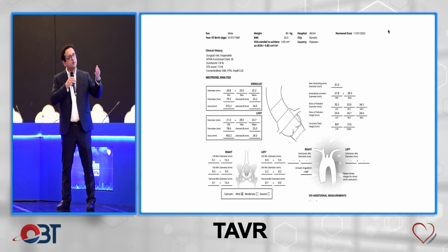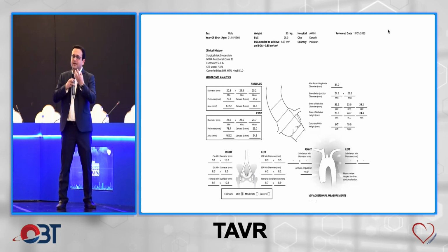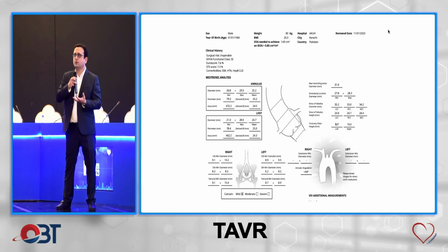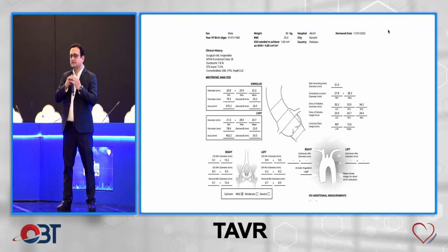And then again for all these parameters, I'll get everybody else to speak as well, but all these parameters have to be in line. जो question आता है वो tight sinuses वाले question में issue आता है, क्योंकि परसों जो हमारा structural का session था उसमें question मुसलसल आ रहा था कि what is the cutoff for coronary heights, और उसका answer was given very nicely by Gilbert Tang कि it's not just one parameter, और वो जो cutoff था that was for sapien. Core valve के there is no one cutoff, आप you look at the sinus heights, you look at the sinus width, you look at the coronary heights, everything in combination gives you an idea whether you should do it or not. Yes, I agree with that.